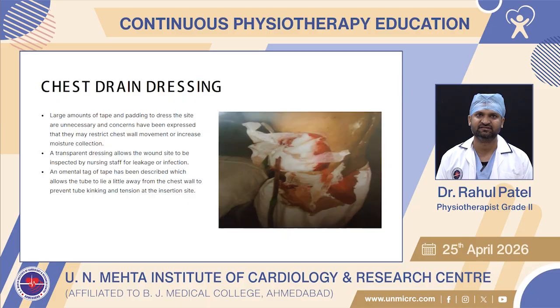Chest drain dressing. A large amount of tape and padding to dress the site is unnecessary, and concern has been expressed that it may restrict chest wall movement or increase moisture collection.